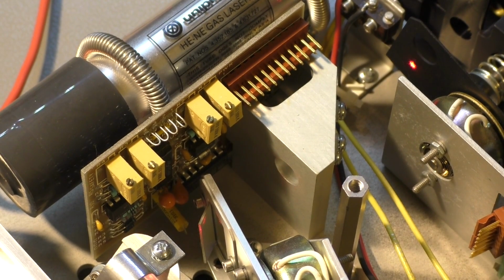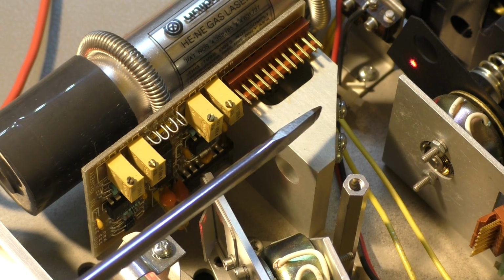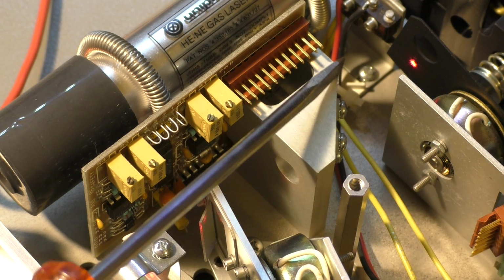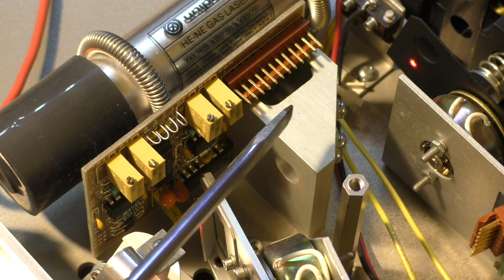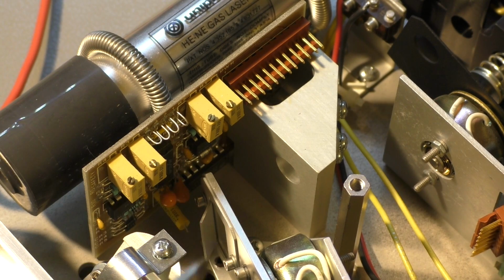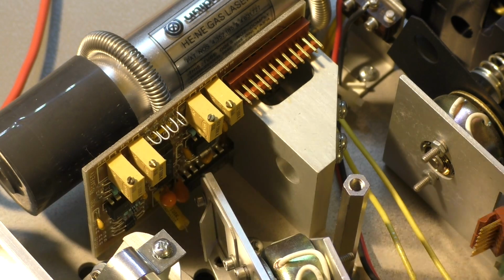we have another feature here. The beam passes through that hole and comes out on the other side, and here in a 45-degree angle there is a piece of glass that reflects a portion of the beam onto that board, and on that board we have some photodiodes that measure the intensity of the beam and give feedback to the power supply to make the beam intensity stable. So you can also select a certain amount of milliwatts, and that makes sure that the output is really what you want.